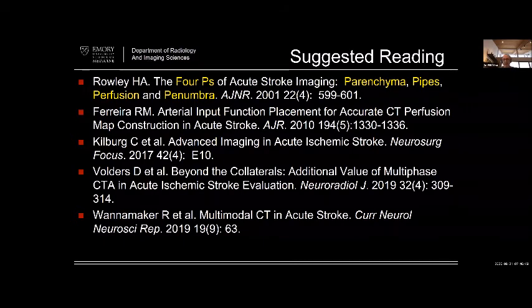There's a question in the box here, Mark, about the correct technique for doing CTA and CTV. What sort of rate of contrast administration do you use? Timing, things of that nature. Yeah, so technically, we have a system with a lot of different places and a lot of different scanners and a lot of different techs. We try our very best to standardize it, but the ways that the CTA would be triggered are different.